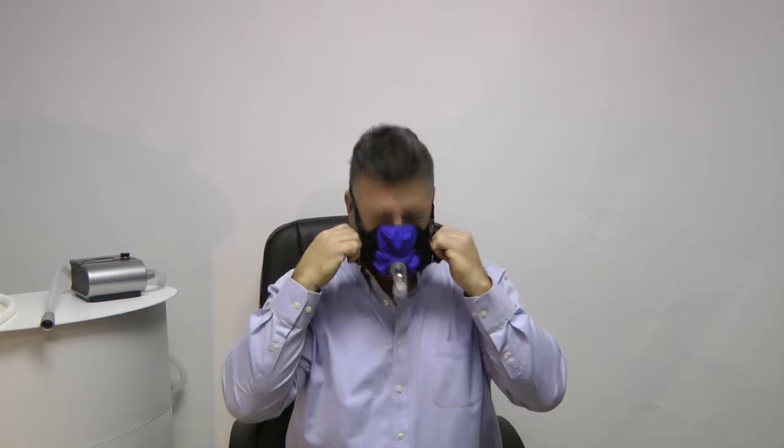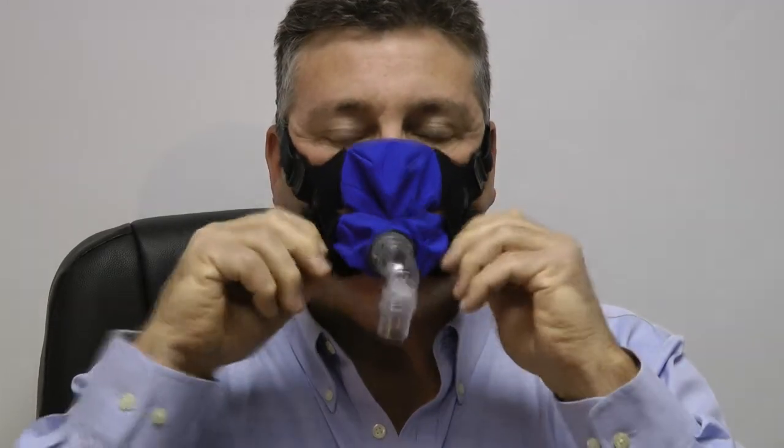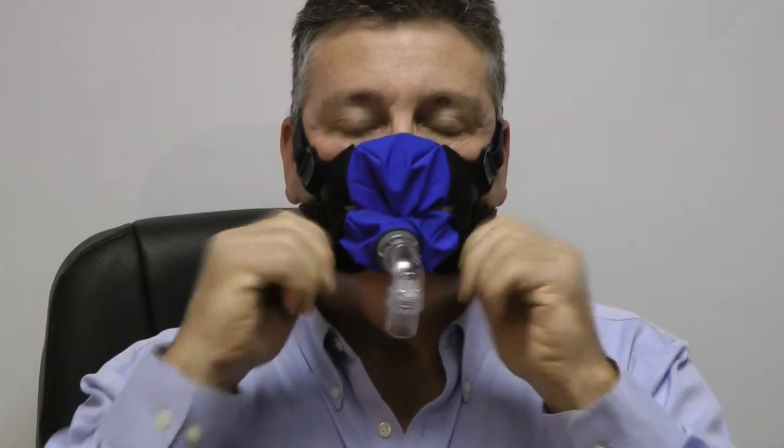Sometimes you'll break a seal, and that could be caused from your jaw moving at night or just by talking with the mask on. So I'm going to show you how to adjust that. When you have your mask on and if you feel there's a leak, what you need to do is make sure your lips are through the bottom hole and make a fish lip with your lips pressing out, then shimmy it a little bit to get a nice tight seal.